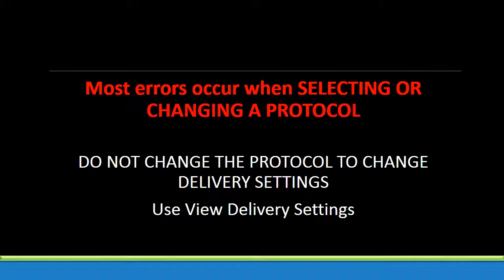Most errors occur when selecting or changing a protocol. Do not change the protocol to change the delivery settings. Any changes that need to be made in any area of the prescription instructions should be done using View Delivery Settings.